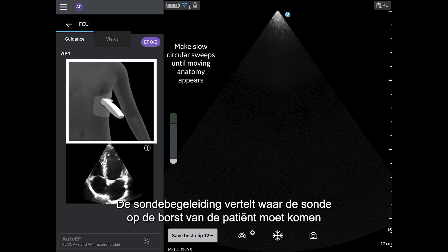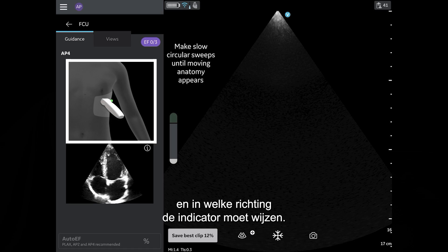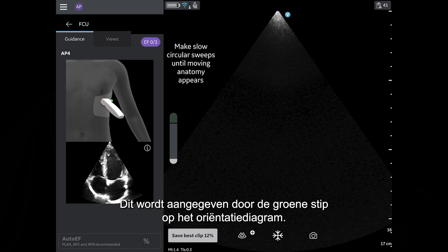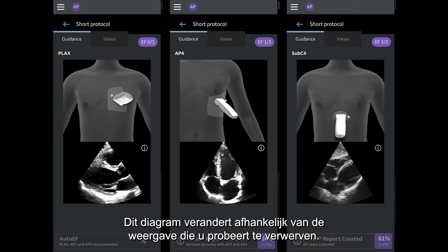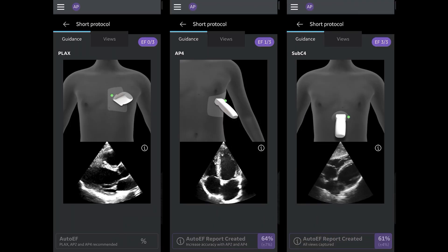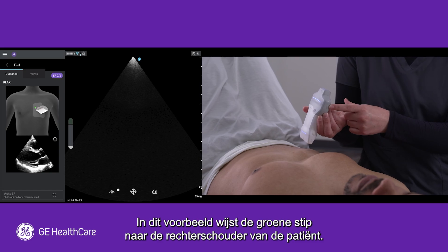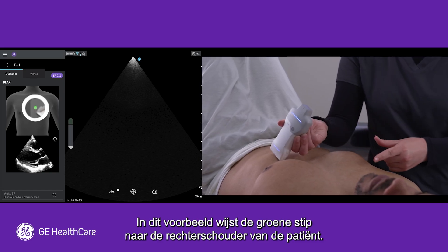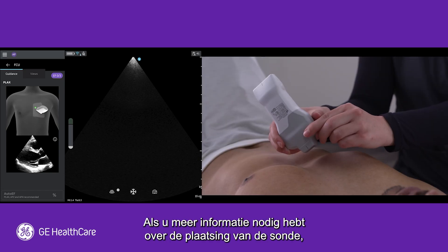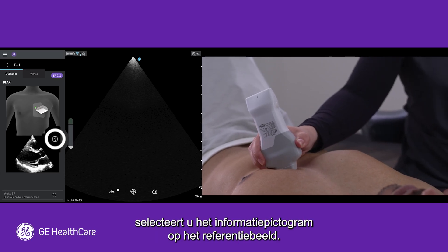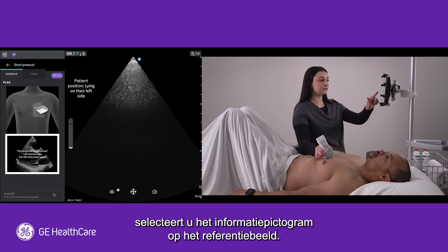Probe guidance informs you of where to position your probe on the patient's chest and the direction in which the indicator should be pointing. This is indicated by the green dot on the orientation diagram, which will change depending on the view you are trying to acquire. In this example, the green dot is pointed towards the patient's right shoulder. If you need more information about probe placement, select the information icon on the reference image.